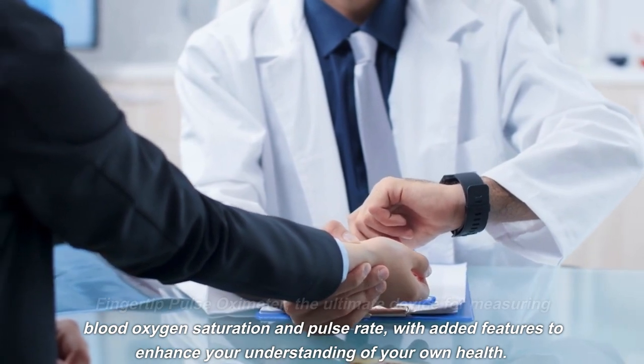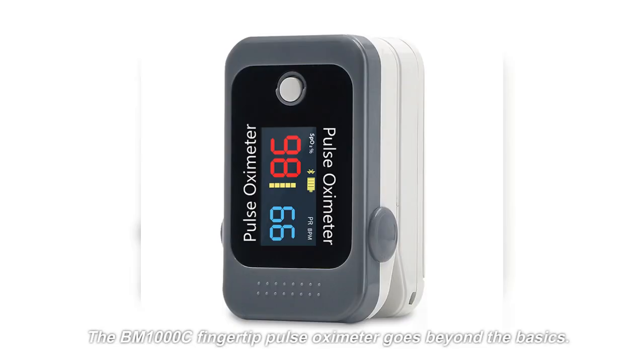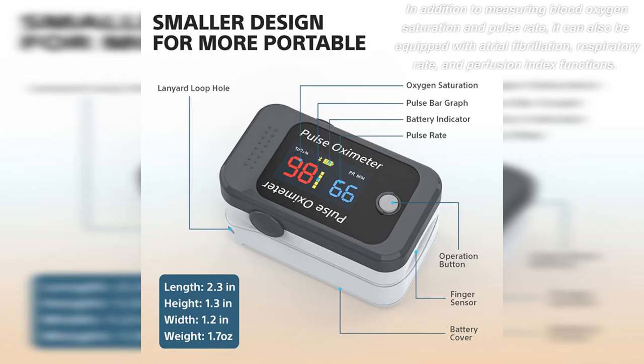With added features to enhance your understanding of your own health, the BM1000C fingertip pulse oximeter goes beyond the basics. In addition to measuring blood oxygen saturation and pulse rate, it can also be equipped with atrial fibrillation and respiratory rate functions.